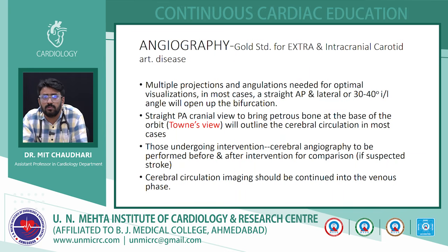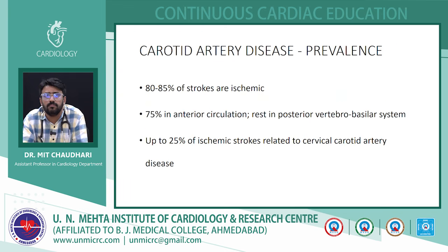One should also take a Towne's view, which is actually a PA cranial view, where the petrous ridge comes at the base of the orbit. In this view we can define the cerebral circulation more clearly, and we should take it as a baseline before any intervention and also after the intervention to compare.